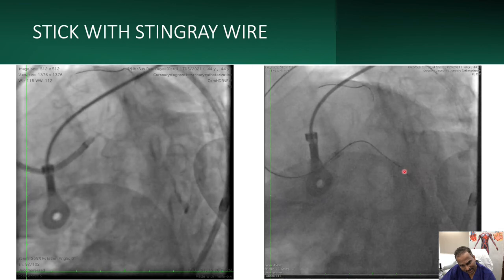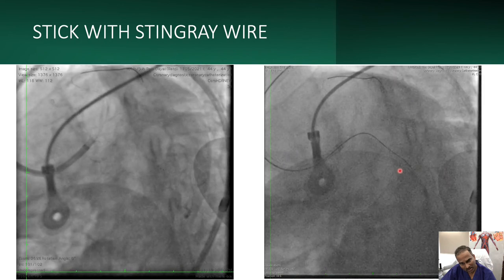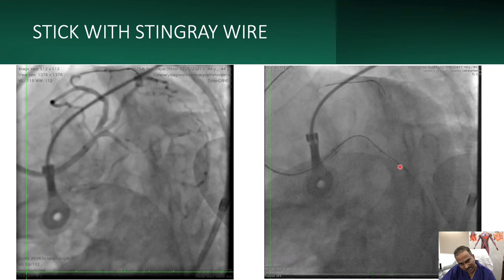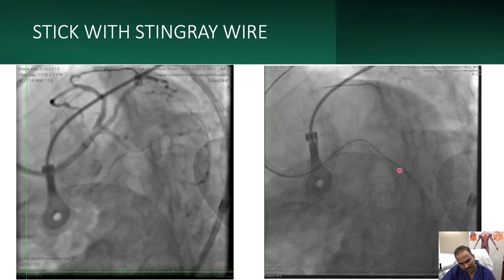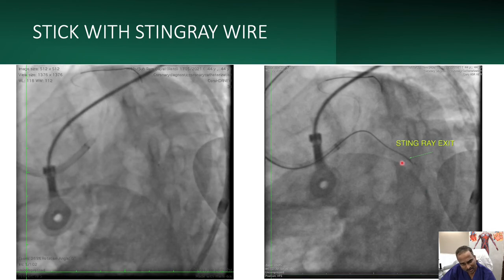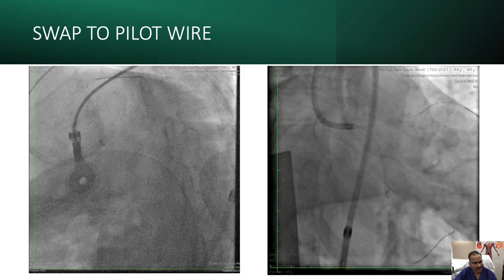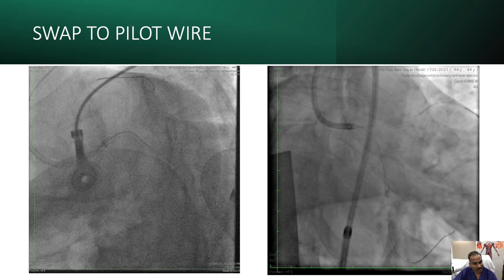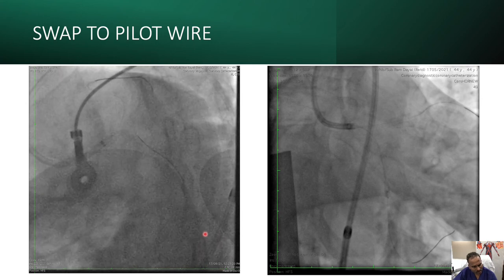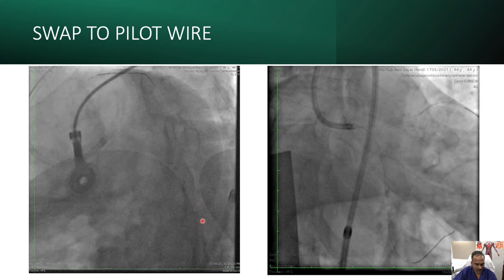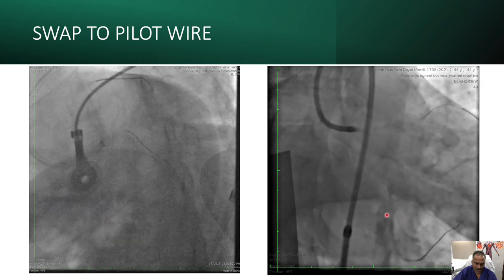We then advance the Stingray wire to give a stick. You can see one exit — proximal to the proximal marker — going into the lumen. This is the proximal marker; this is the distal marker. The Stingray wire just entered into the lumen from this exit. Once entry was created, we swapped to a Pilot 50 wire, which went easily off the Stingray exit into the true lumen. A check angio confirmed the wire is in the true lumen.